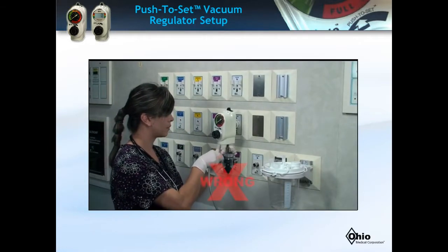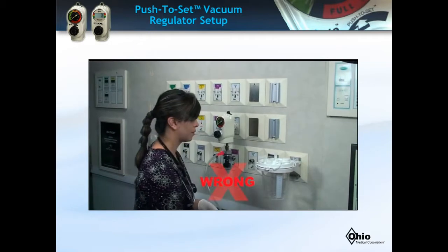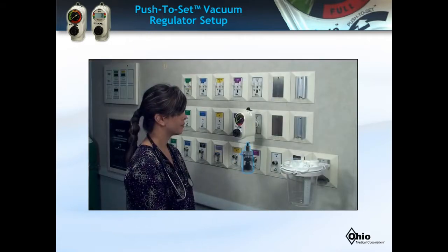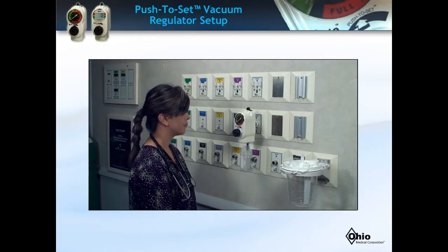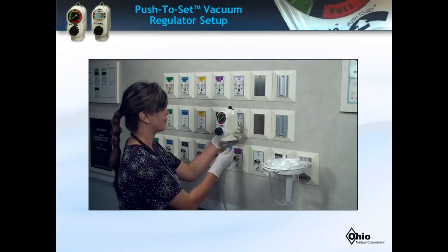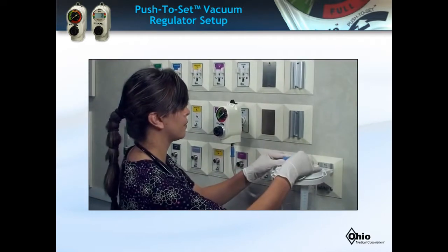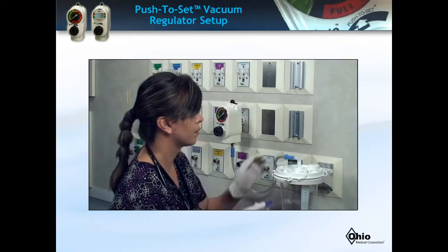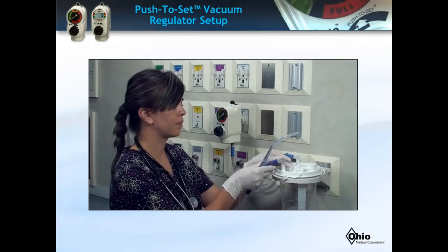The patient tubing is never connected directly to the vacuum regulator. If an overflow safety trap is not used at your facility, the tubing is connected from the regulator to the canister, and the proximal patient tubing is connected to the top of the suction canister.